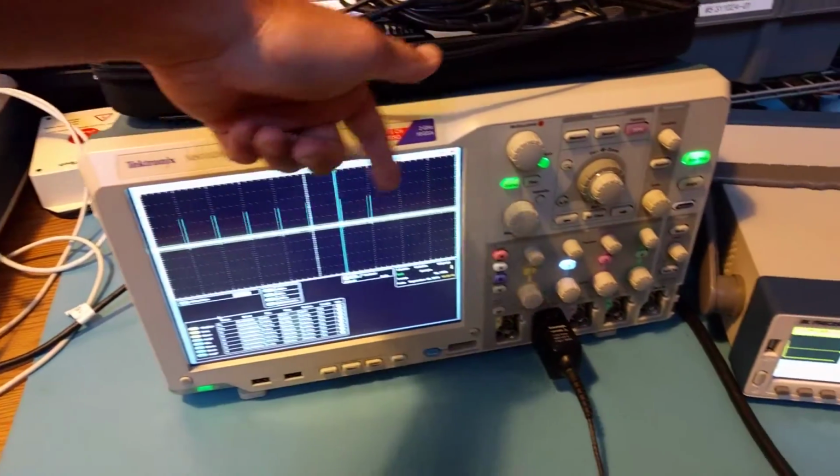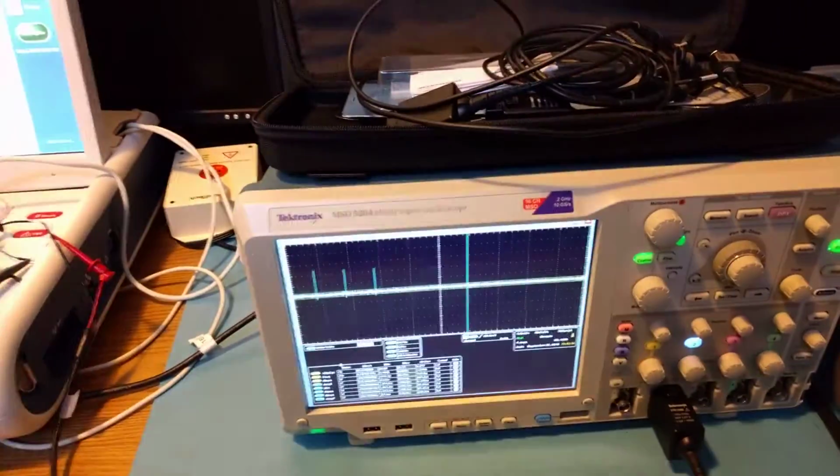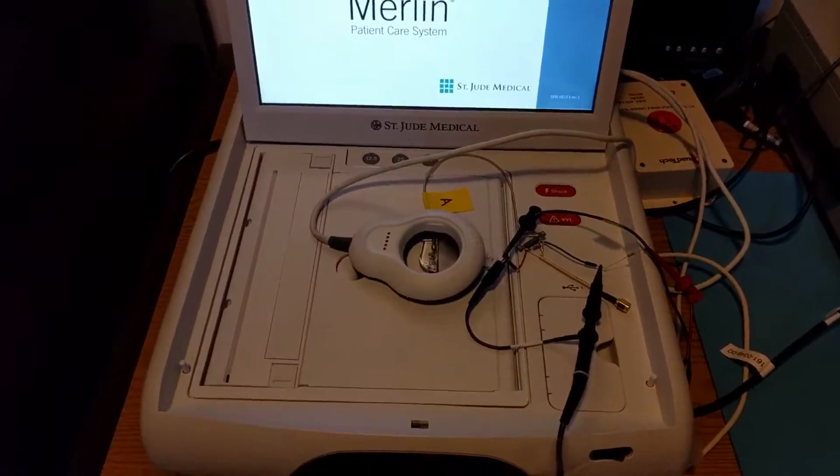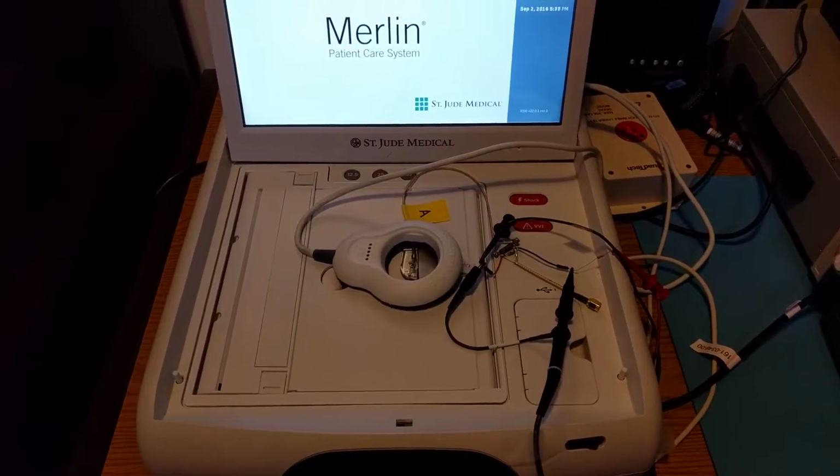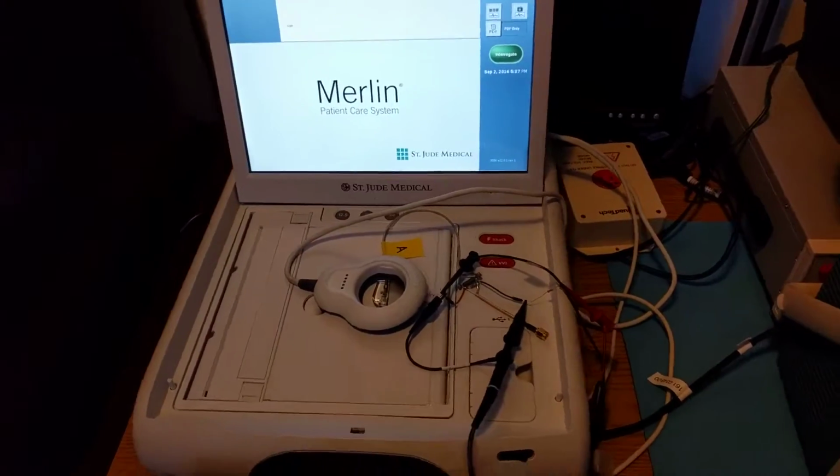If we turn it on, we notice that the pacing has been inhibited, and if we turn it off, we notice that the pacing starts again, because the pacemaker has been put into the VVI mode. That way we can observe that sensing and pacing is happening as expected.